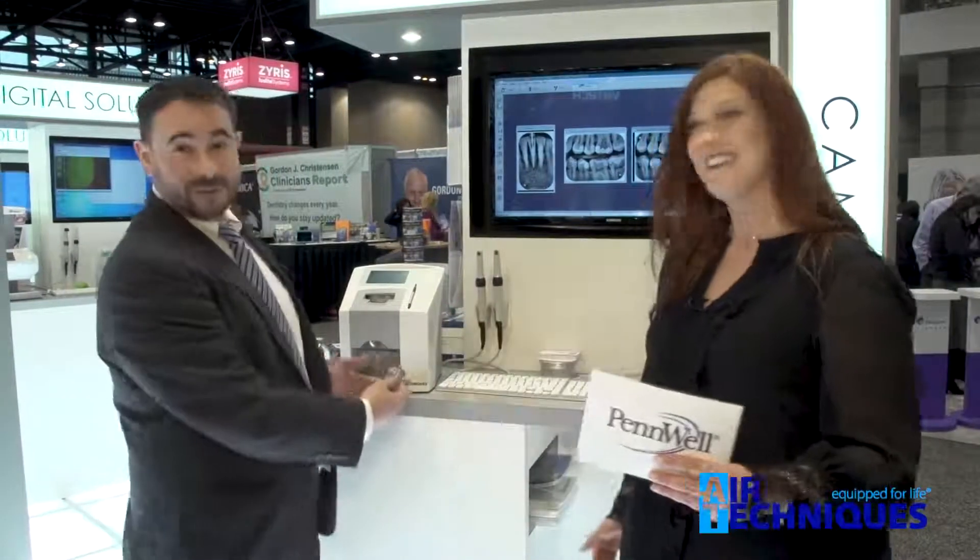We're at the Chicago Midwinter Show and we are experiencing a brand new product. Tell me about it. So yeah, this is the ScanX Swift View. It's the newest product in our scanner portfolio.